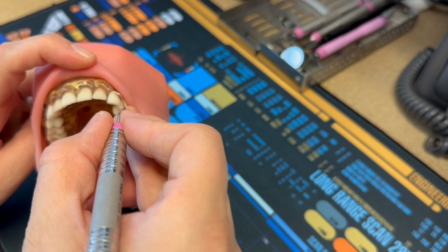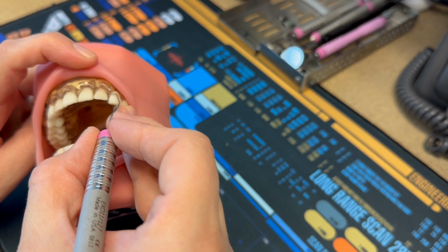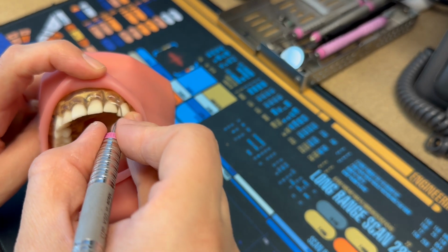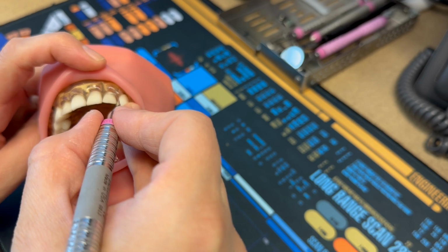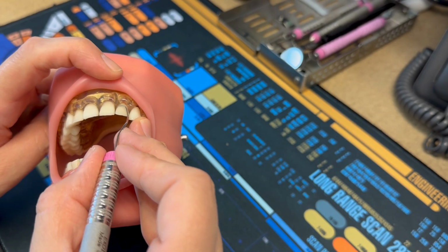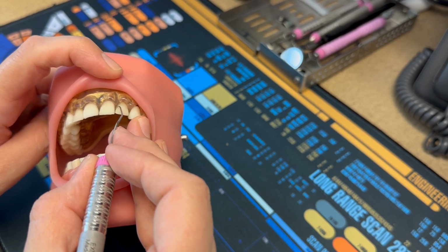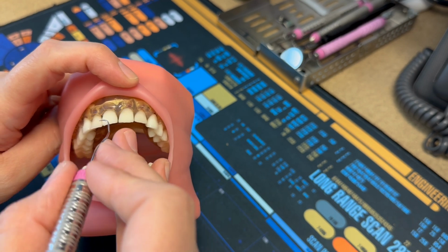Okay, and with every stroke, I'm ensuring that I'm using a wrist rocking motion, and I'm also ensuring that with every stroke, I'm rolling to adapt. And that is the correct sequence. So you'd work that way.